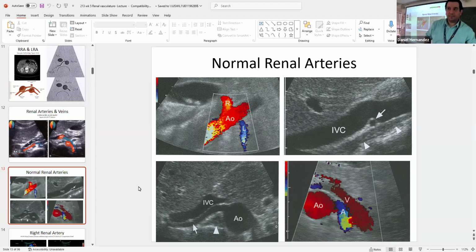Hey Dan, in that image, is that the kidney, that anechoic structure there that the right renal artery is running towards? I feel like that's probably gallbladder with some little stones in there. Okay. Kidney is going to be farther up. Gotcha. Yeah, it's got to be further out. What's that branching to it then?